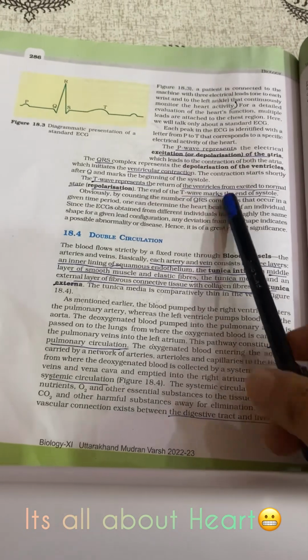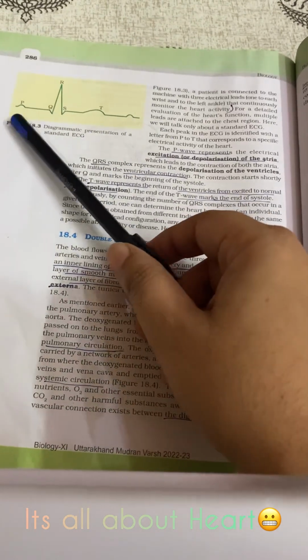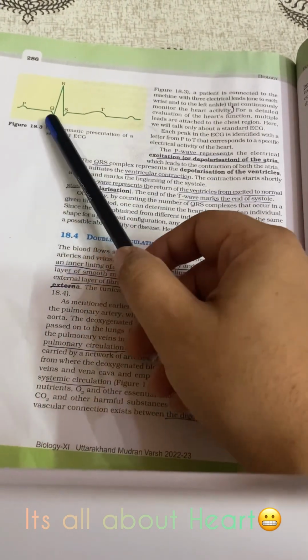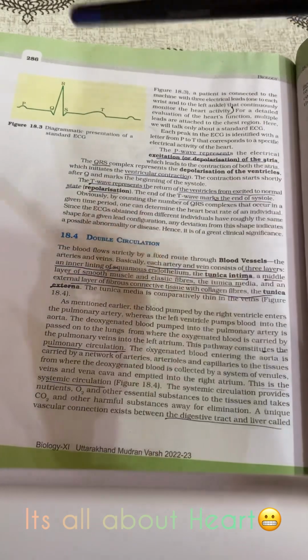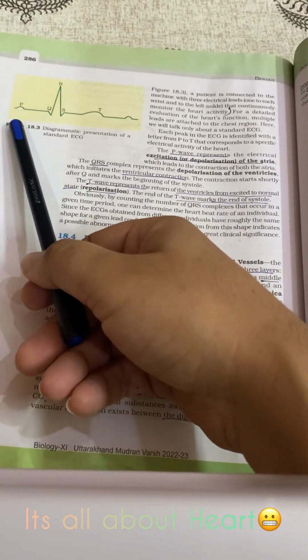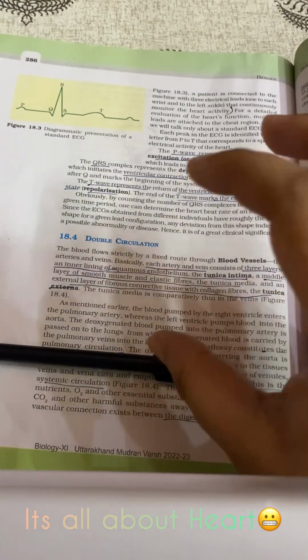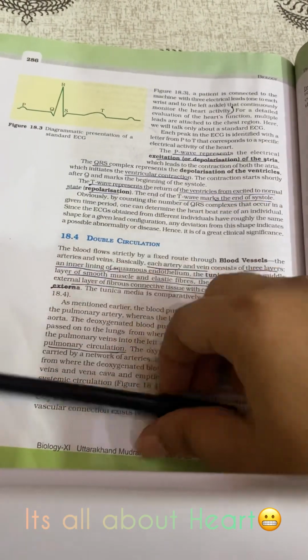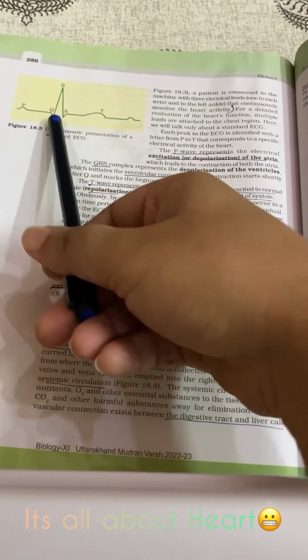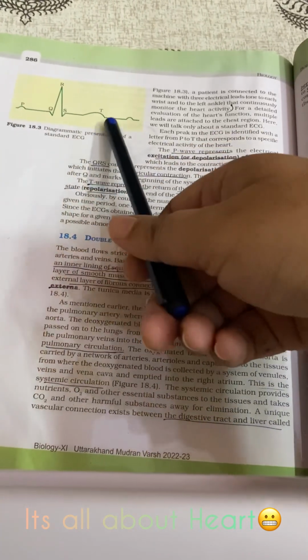The ECG, the electrocardiography of the heart, is represented by letters from P up to T, that is P, Q, R, S, T. It has three components. We can see the P part represents the contraction of both the atria. The second complex is the QRS. The first part is P, the second part is QRS, and the third part is T.